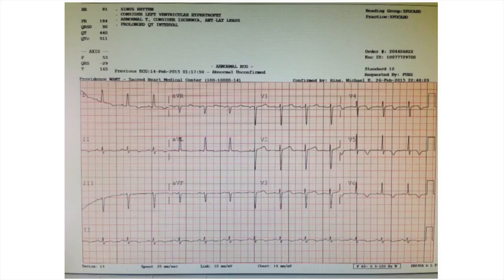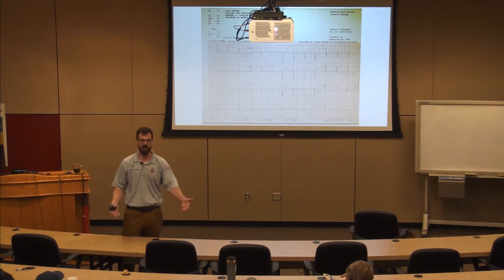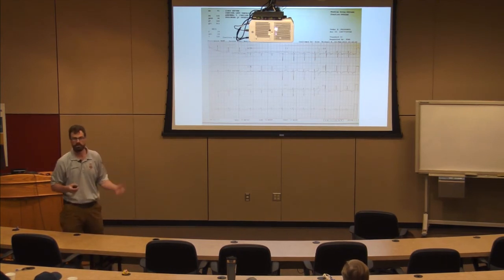I don't know what the medication was. There's a whole plethora. There's a pharmacy of meds in the house, right? She took a bunch of them. And how do I know whether or not there's some sort of cardiac monitoring that needs to take place on this person? Well, I'm going to look at intervals on my 12-lead EKG. So I get a 12-lead, and I look at the QRS. Do I have a wide bizarre QRS? No. Do I have a long QT? Yes, I do have a long QT. This person is high risk for torsades and should be monitored.